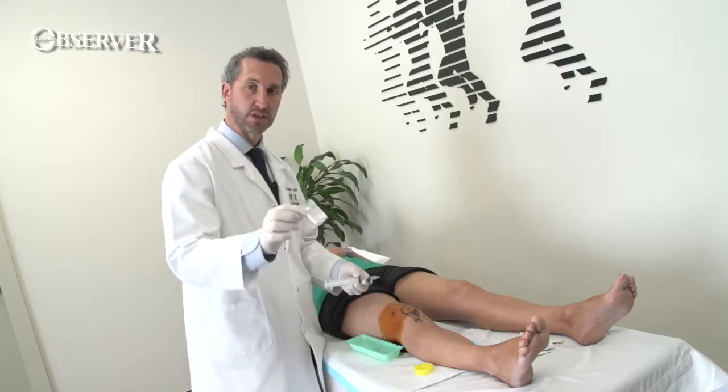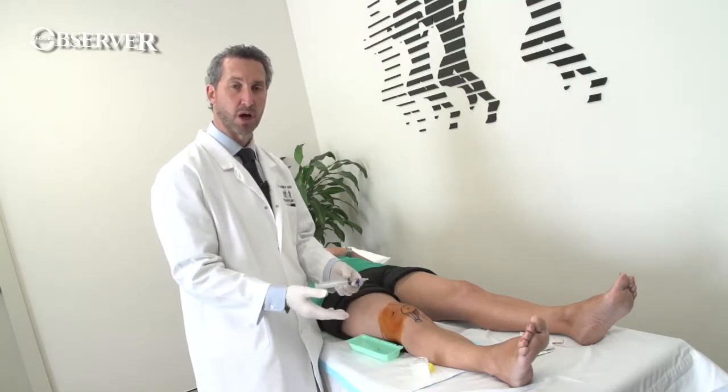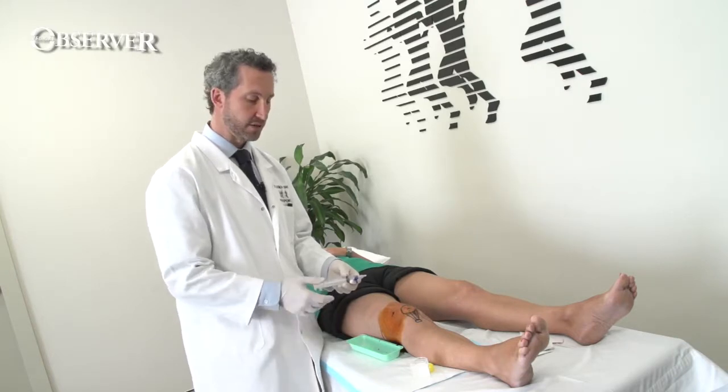Don't forget to have your sterile jar immediately available. You probably want to send some of the fluid to microbiology and some for histopathology if you're not certain of the diagnosis.